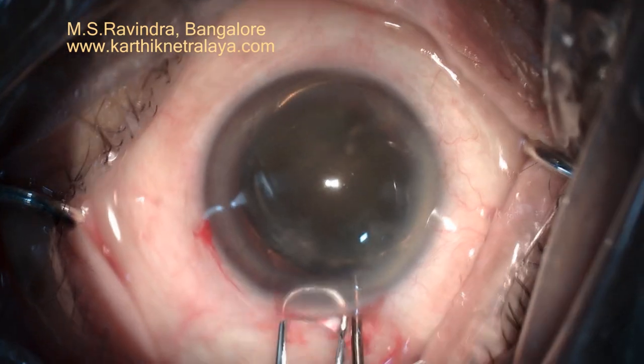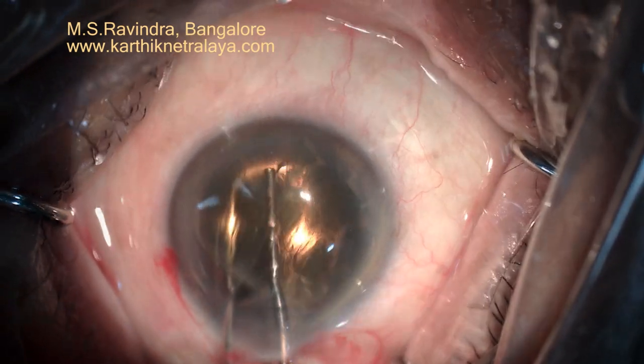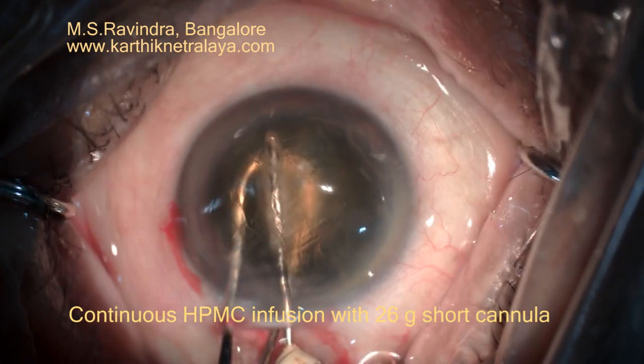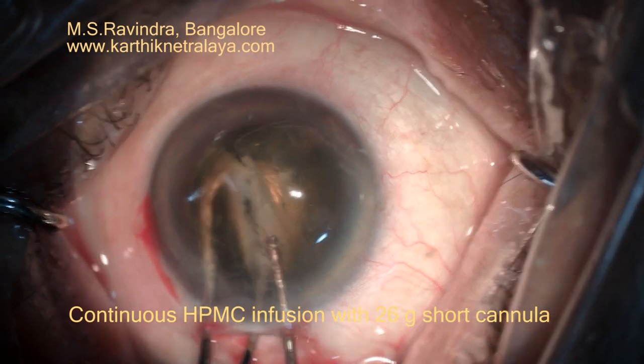Ensure that the entire nucleus is in the entry chamber. Because the tunnel is of small size, less than 6 mm, I need to trisect the nucleus so as to not damage the tunnel while extracting the nucleus.